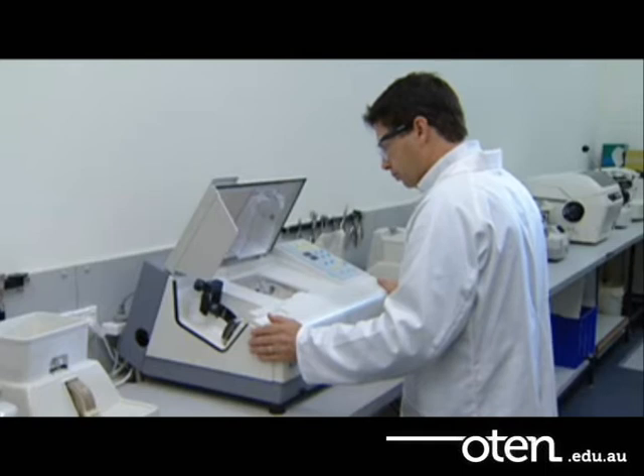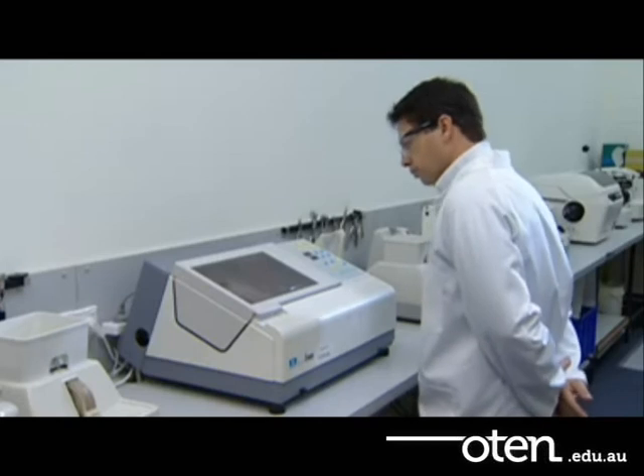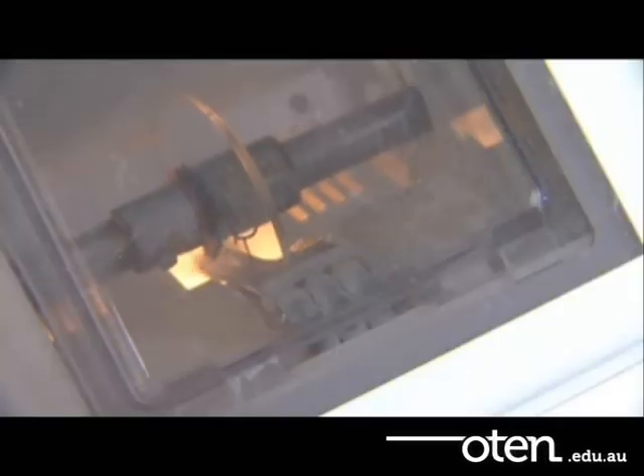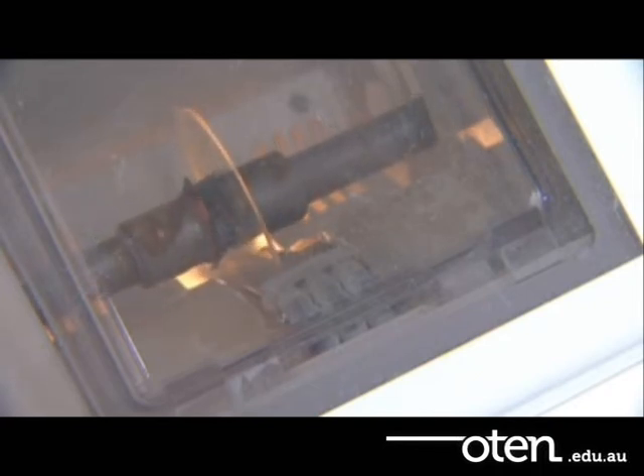We always process the right lens followed by the left lens, so what's done for one lens will be done for the other. Cut the lenses down to size on the cutting wheel, which deals quickly with the excess material.